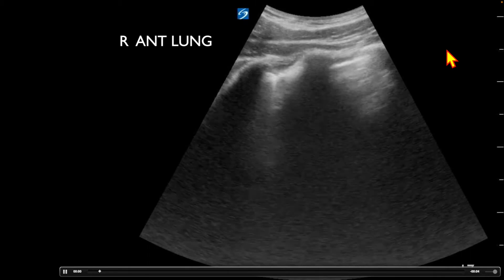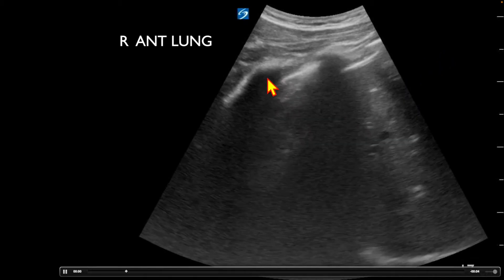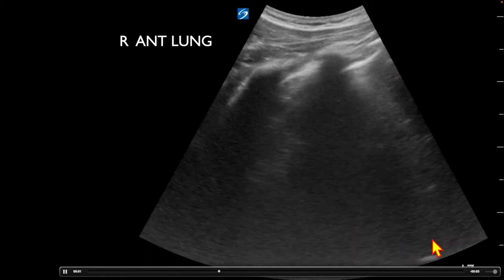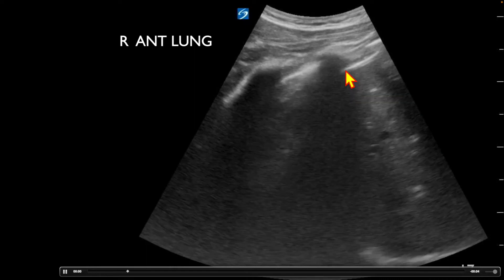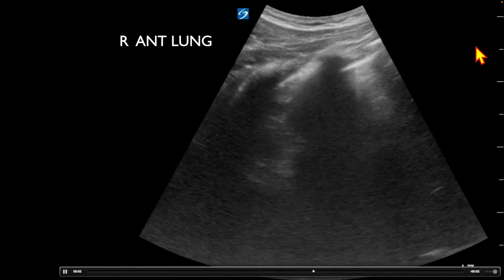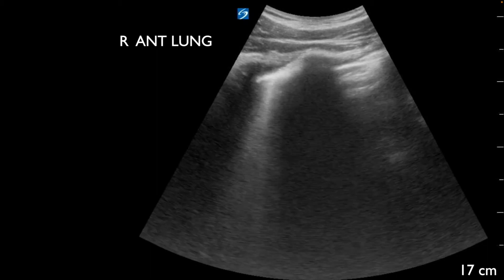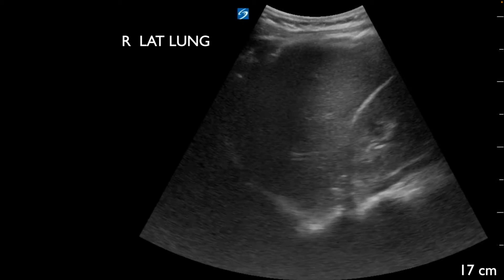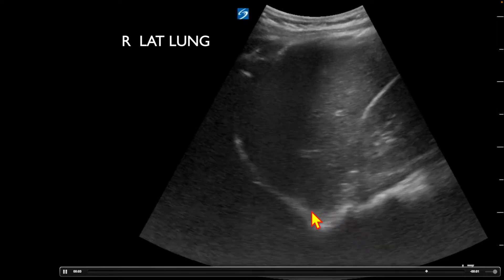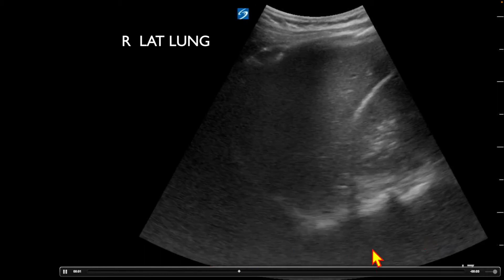To be diagnostic we have to find a lung point. Moving down to the next view — again we have rib, rib, and then we have the pleural space here where I see lung sliding. We also have the liver here, and we can see the lung anteriorly as the patient takes a breath in, obscuring the liver. The second anterior view looks very similar to the first. Then we're going to look at the lateral lung and see our spine line come down and disappear into the diaphragm, which would signify that there is no pathology in the lower lung base.